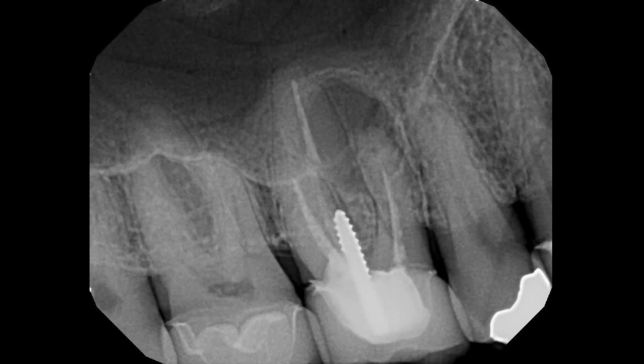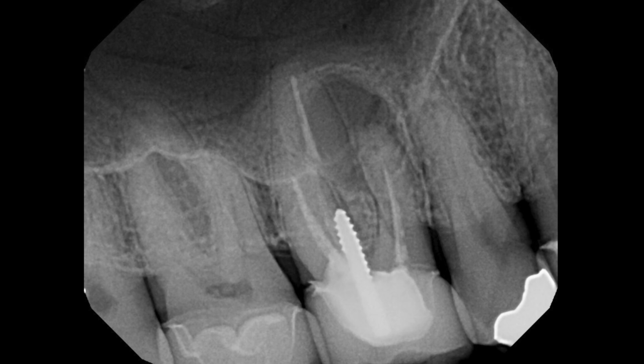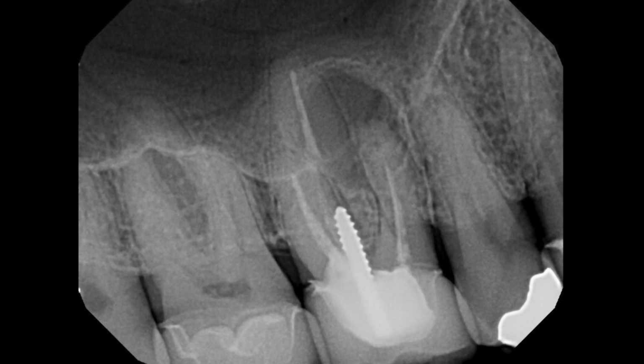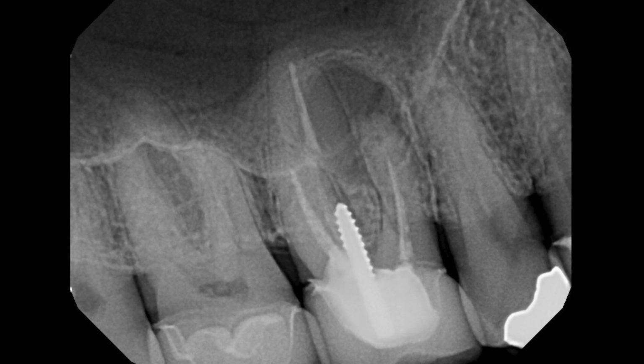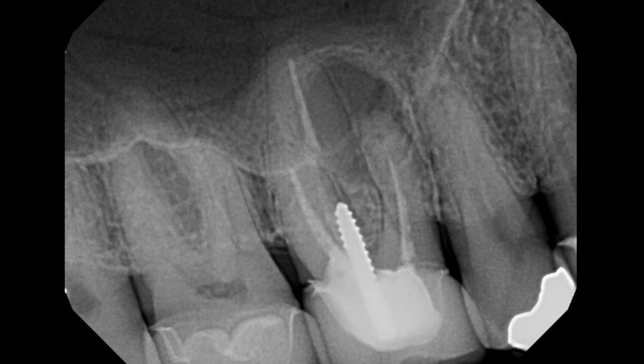All right, so this patient that came to see me was having acute pain associated with this maxillary right molar. And as you can see, the tooth has had a previous root canal, post, and a crown. There is somewhat of an open margin on the distal. It's usually not ideal, but this is a fairly recent crown. And you can see that there is a very large apical radiolucency around the mesiobuccal root, and that the mesiobuccal root canal fill is fairly short of the root end.